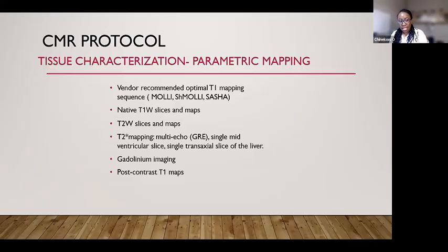Now, we know that in certain disease states, especially if you have expanded extracellular space, the gadolinium wash-in and washout time is delayed because it hangs in the extracellular space. Therefore, if we have myocardium that has normal parts and parts that have expanded extracellular space, as seen in scar or acute inflammation, then at the time point that gadolinium should go in, it would have gone into the healthy myocardium. But if the blood supply is reduced in certain areas, it might not have gone into unhealthy myocardium in some areas, like in coronary artery disease.